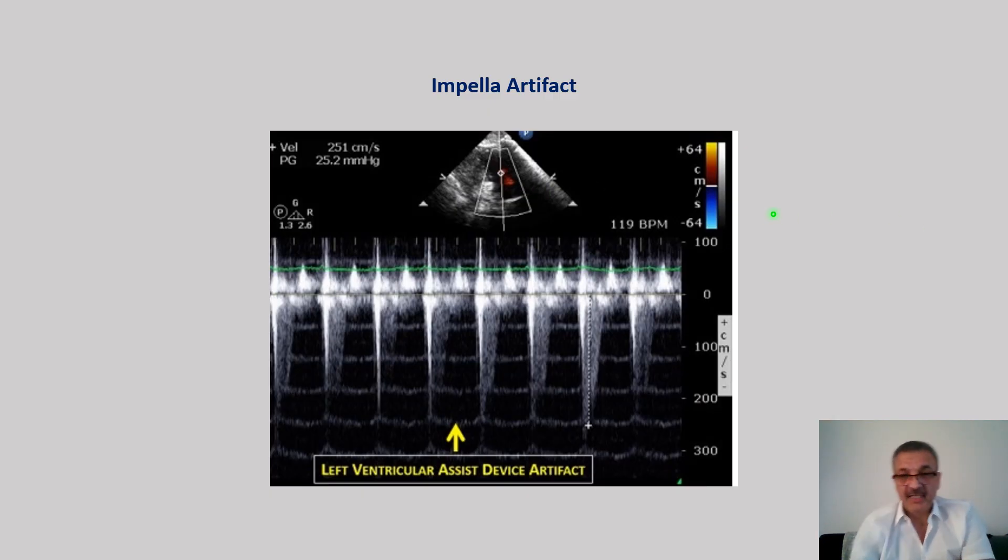One important point about Impella artifacts: when you perform Doppler on a patient with an Impella, be aware that the motor turbine creates a regular artifact visible on Doppler. However, if you optimize your Doppler settings, you can still obtain TR or any other Doppler evaluation you need. I hope you liked it — don't forget to leave comments and questions. Until next time, have a wonderful day.